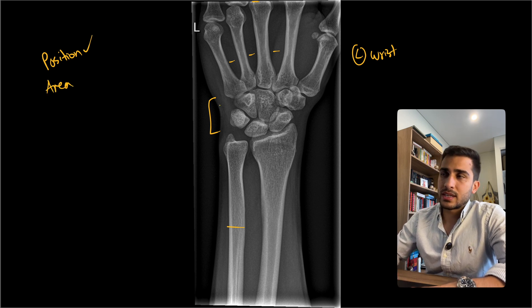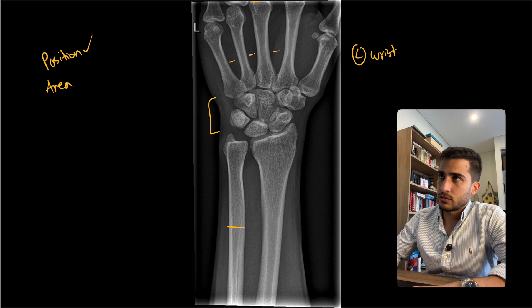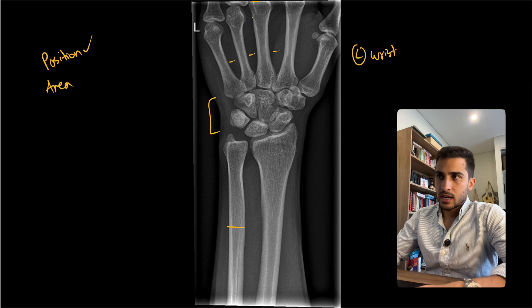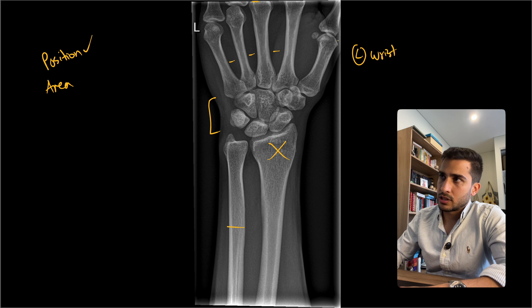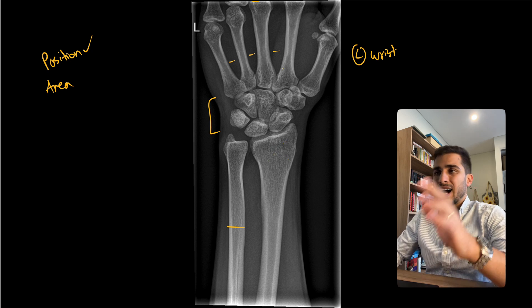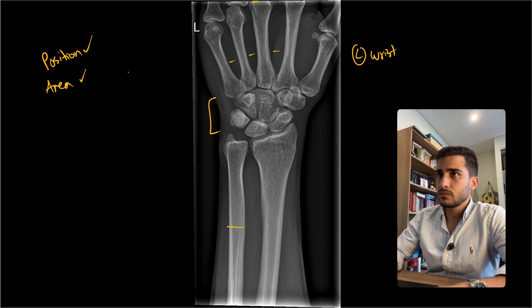Next, is there anything cut off in the area? Ideally we should have the top of the third metacarpophalangeal joint, or basically all of the knuckles. This one has cut it off a little bit — not ideal, but it depends on where the region of interest or pain is. The same goes for the thumb; a little bit is cut off on the side, but if there's no pain there, not really a complaint. So borderline on that one.